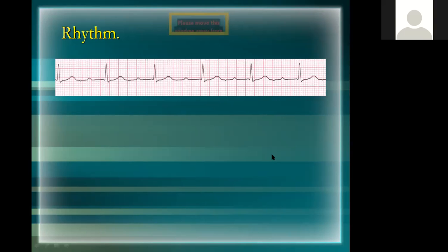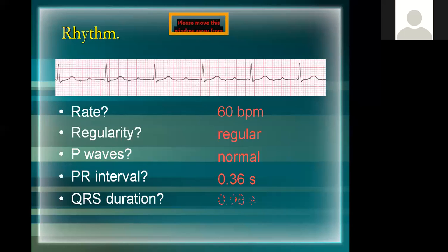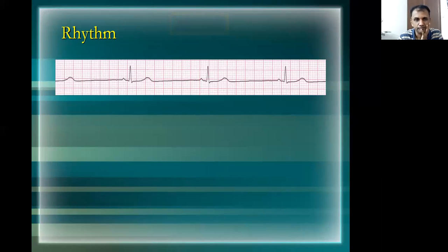Praveen, sir. You got the diagnosis, Praveen. Yes, you could see the P wave here, and that QRS complex here. First degree AV block. Yeah, absolutely. That's first degree because there is a prolonged PR interval in the ECG.